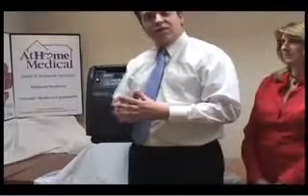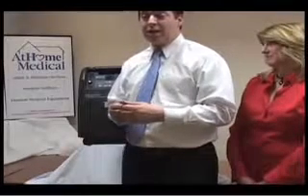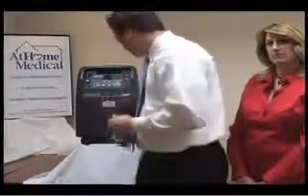Your physician has prescribed the liter flow that's needed in order to maintain the appropriate oxygen saturation levels. Again, please remember that oxygen is a drug, and you may not, without a physician's order, change your liter flow.